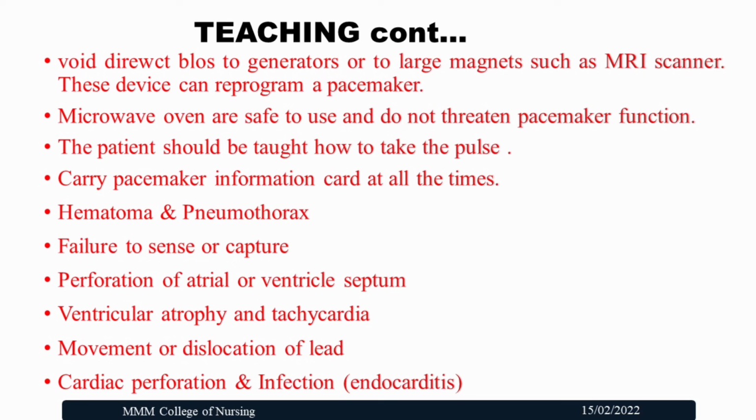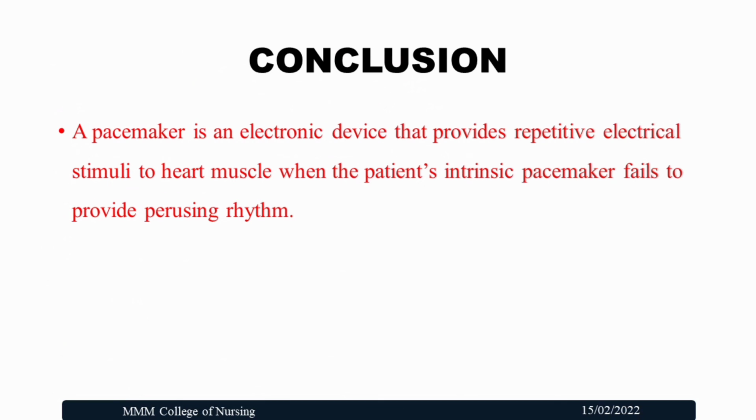The patient should be taught how to take the pulse, and should carry the pacemaker information card at all times. Complications like hematoma, pneumothorax, failure to sense or capture, perforation of the atrial or ventricular septum, ventricular tachycardia, dislocation of the leads, cardiac perforation, and infections like endocarditis can be seen after pacemaker implantation.